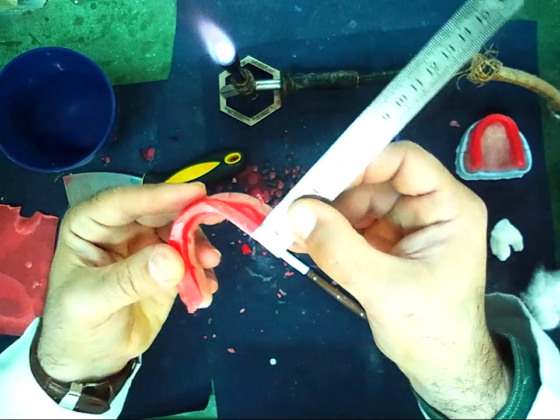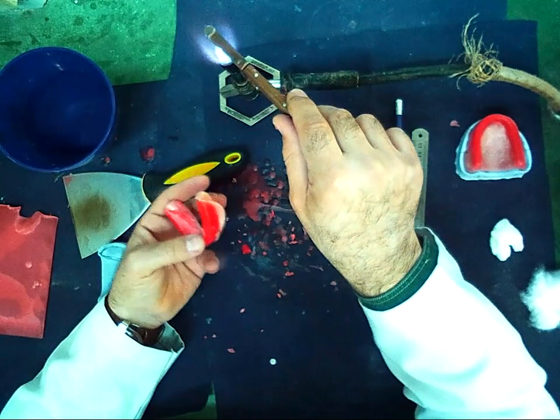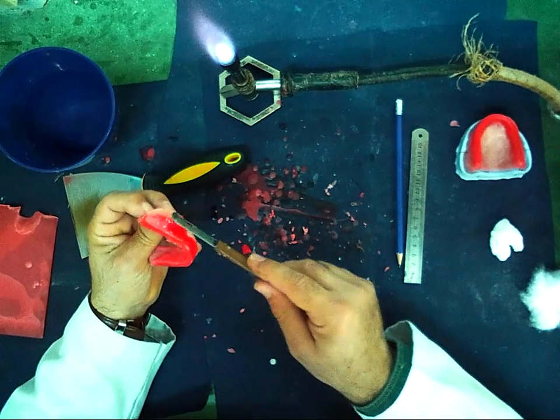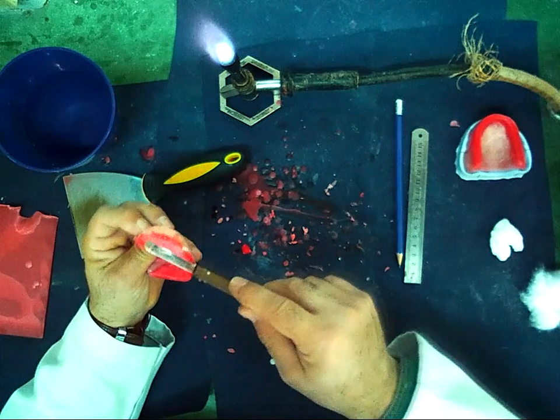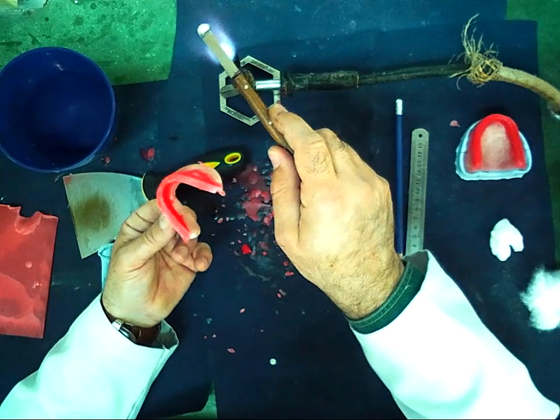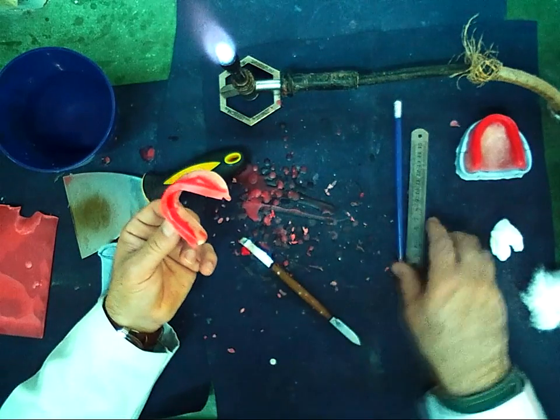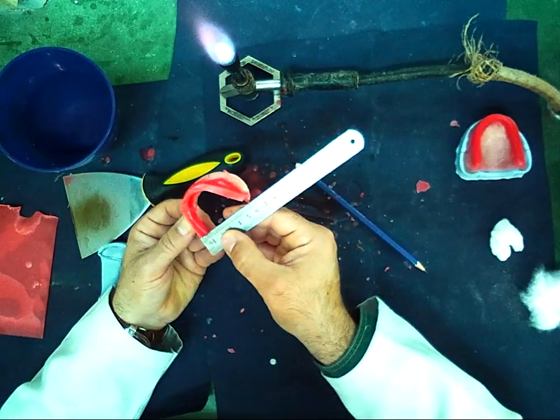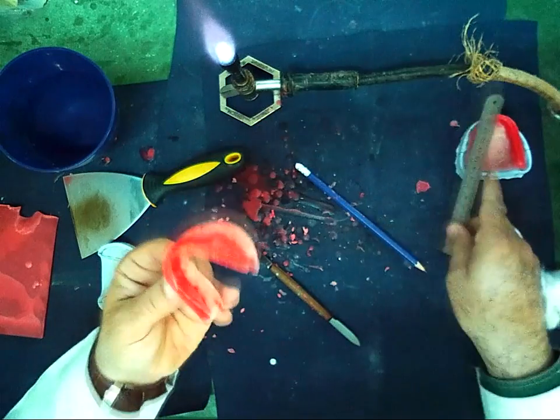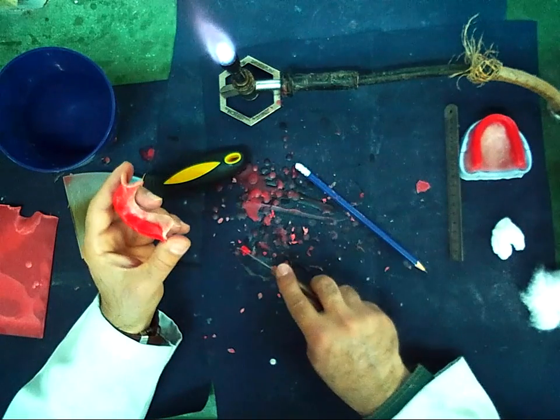It is 7 mm. The other side. 7 mm or so. Now I should close the space between the wax and the record base.